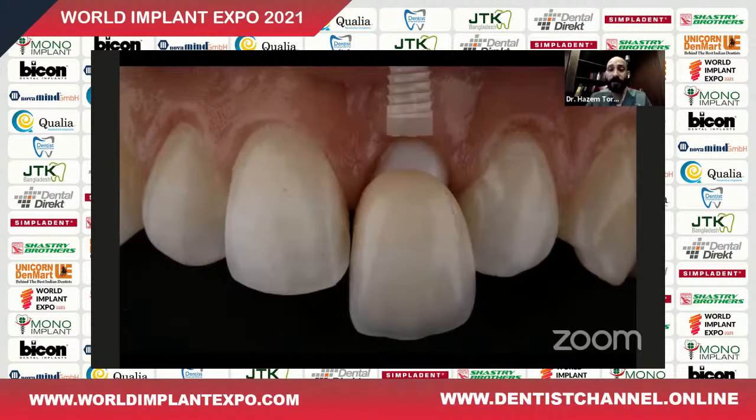This is a factor that we need to put in our mind clearly in every single implant placement that we do. We're not only dealing with an implant or a fixture that is placed into bone, we are dealing with peri-implant tissues. And the peri-implant tissues include bone. It does not necessarily mean that we are dealing with one factor. We are dealing with bone, with tissue, we are dealing with a living organism, and we are dealing with a patient that has their own requirements and their own workflow that is custom for this patient.